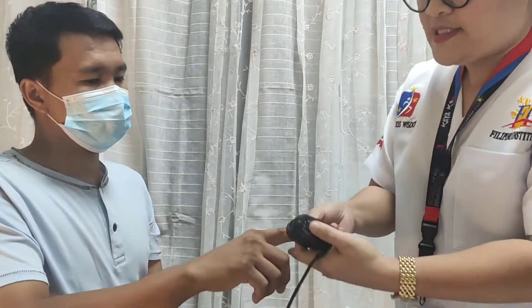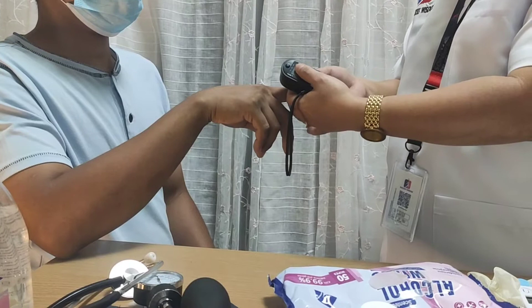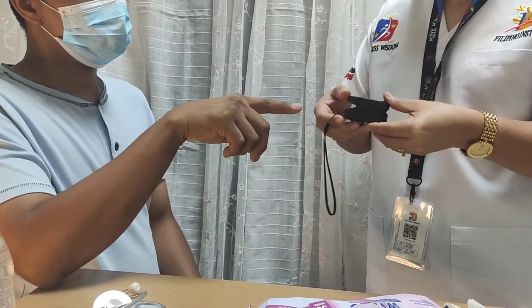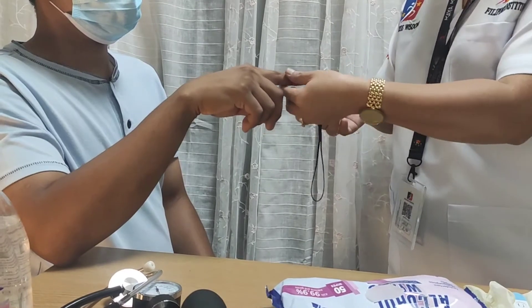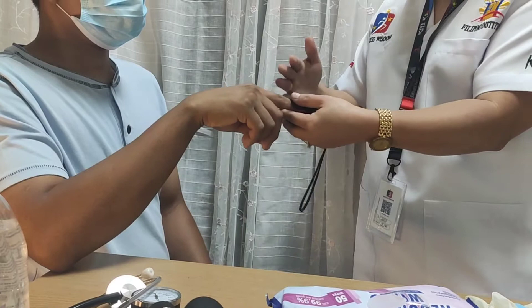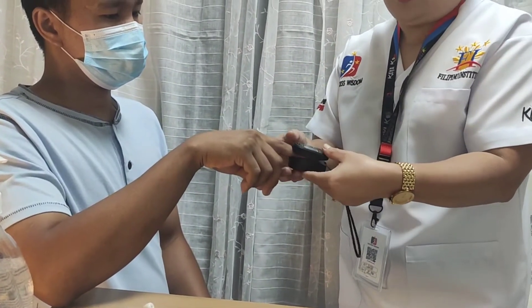To check the oxygen saturation: warm the selected site — the SpO2 probe site, such as the finger. Start the oximeter by pressing on. Insert or clip the finger on the device. Wait until the result appears, and then document the result.